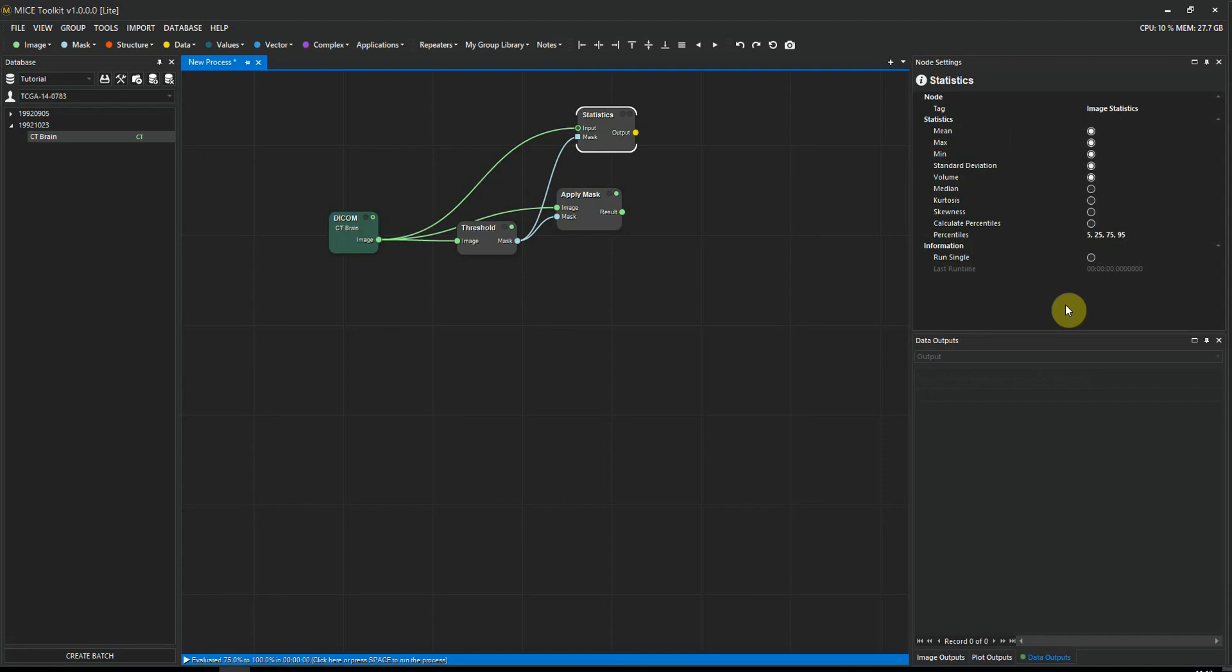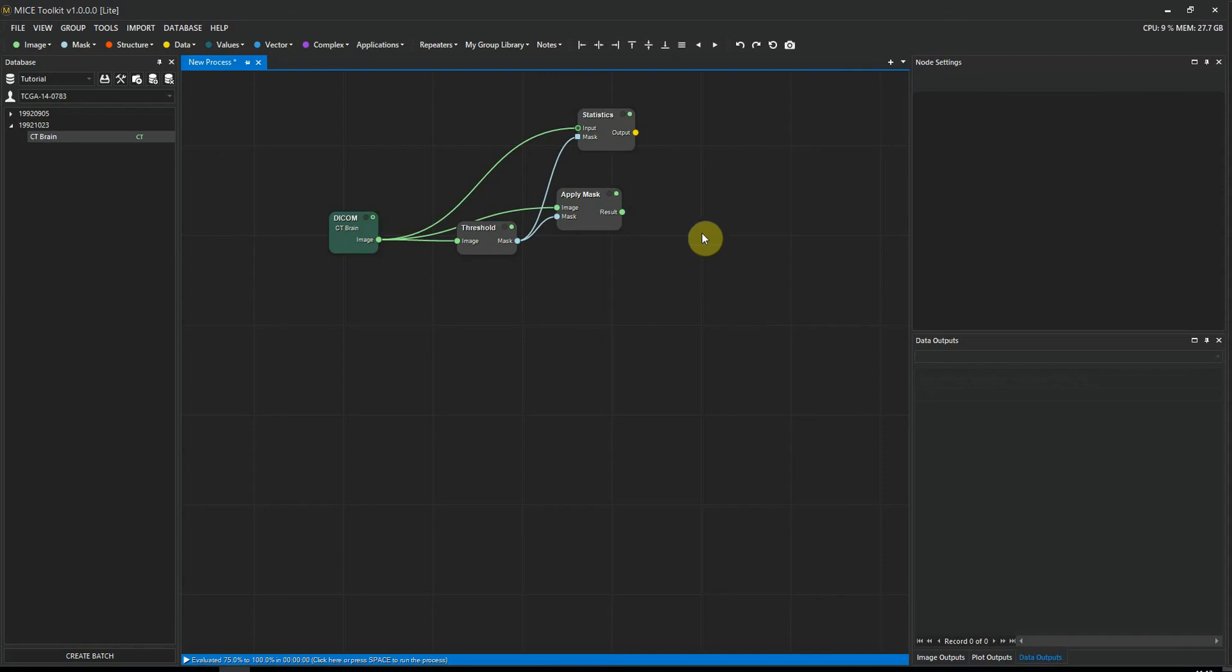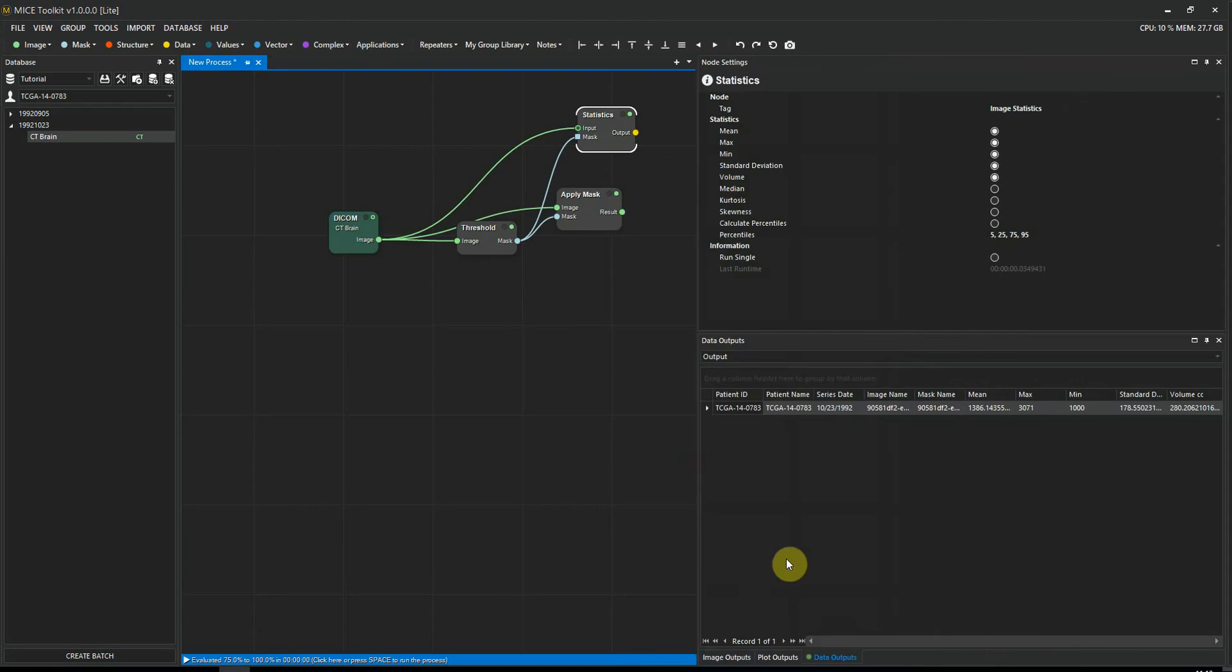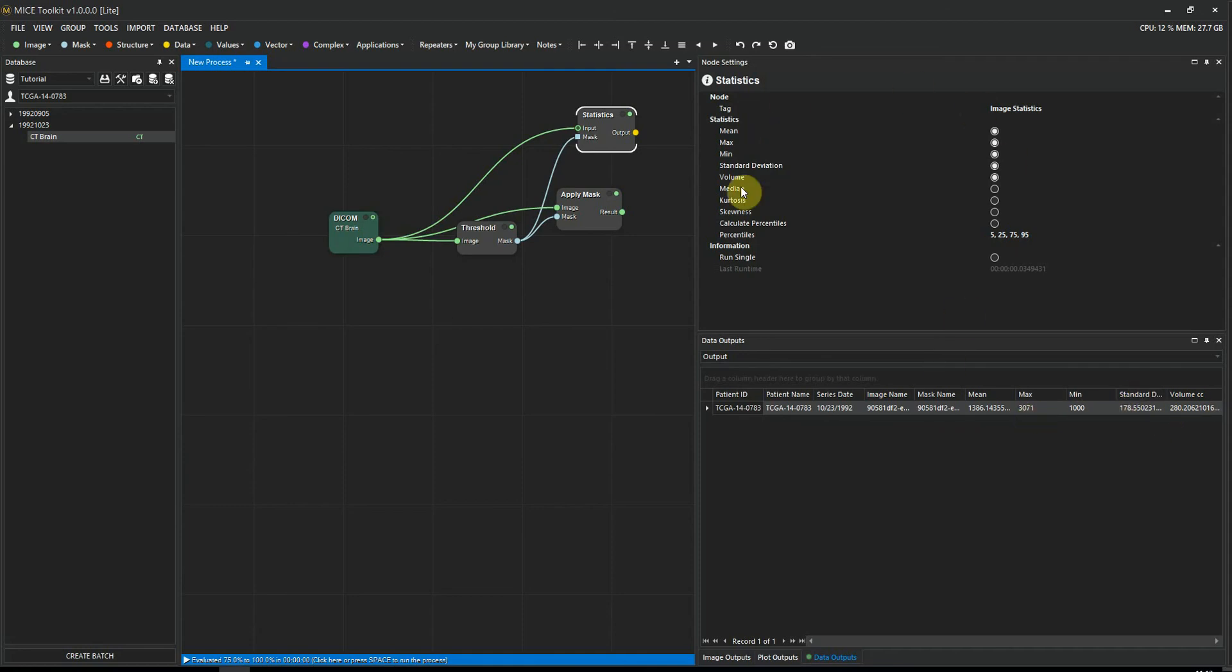This looks fine, so I'm going to hit spacebar to execute the workflow. If we highlight the statistics node now, we can get a glimpse of what the statistics look like by going to the data output panel. We can see the patient ID, the patient name, and some statistical properties that we selected to calculate in the node settings.